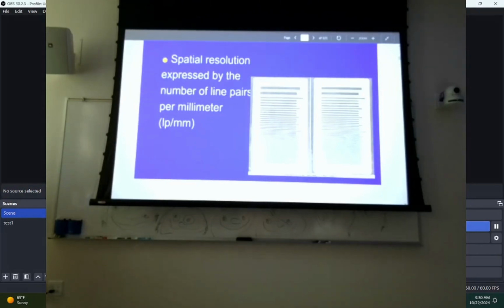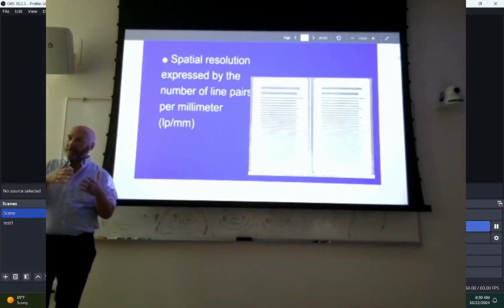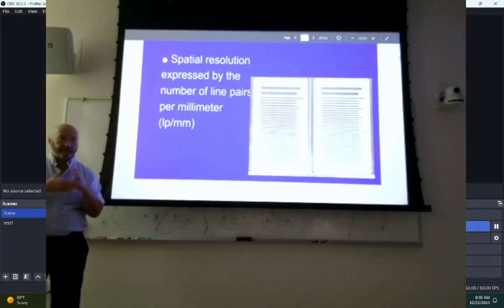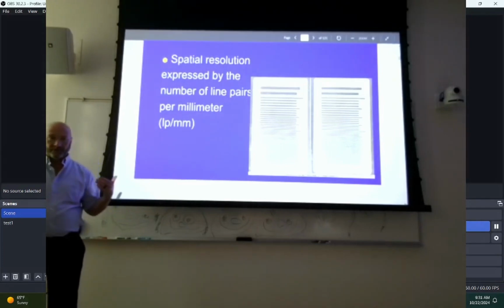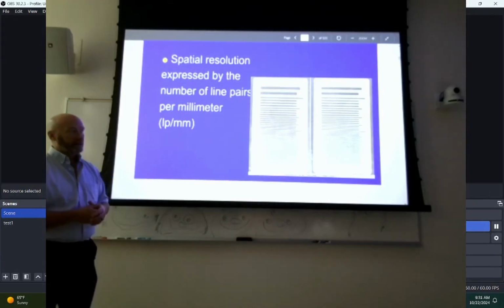What does the focusing cup do? Make sure that they stay together. Right, it mashes the electrons together so that whenever they go across the tube, they're all negative charges, right? So if they're all negative, they have a tendency to want to push each other apart. But the focusing cup crams them all together so they hit a specific portion of the anode, the focal track on the anode. And if we lose that charge on the focusing cup, then the electrons go everywhere and focal spot size can increase.